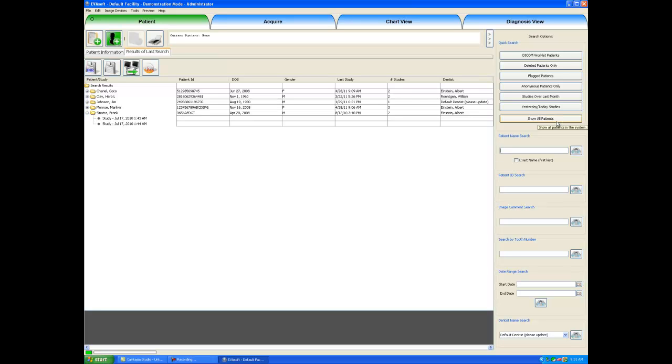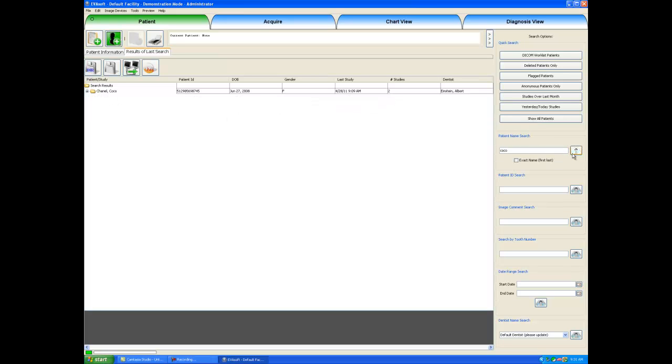For a more advanced search, we could go down to these different fields here. For example, I can enter in a patient's name and hit search, and any patient with the name Coco will show up, and of course we have Coco Chanel in our database.